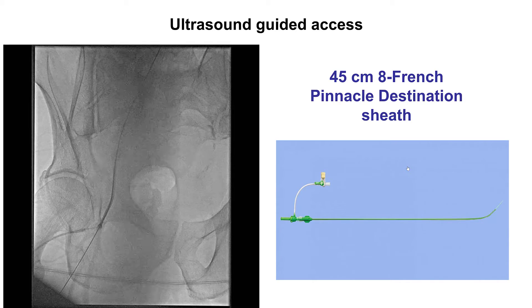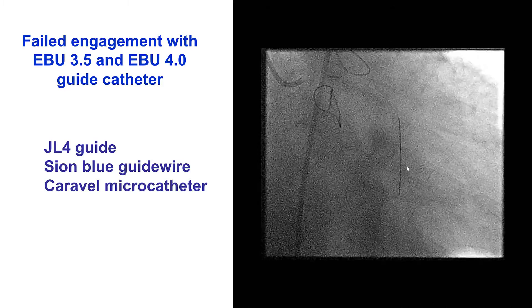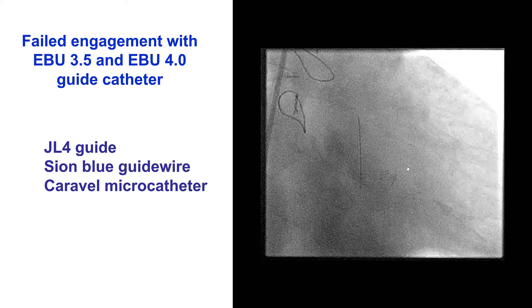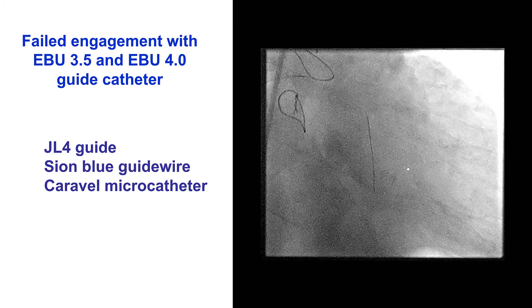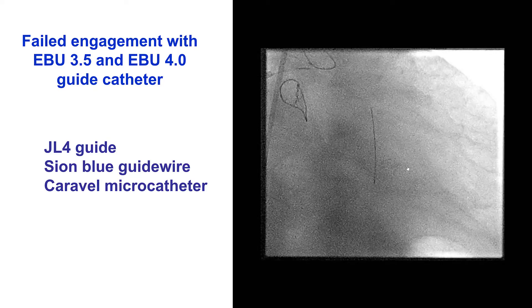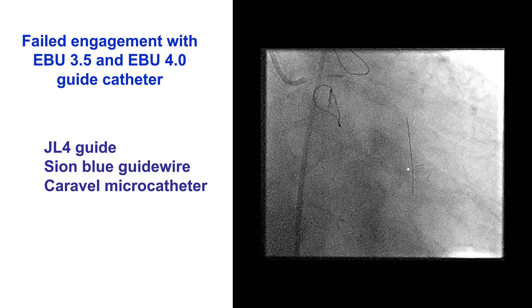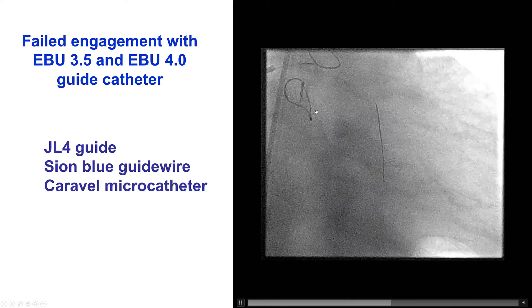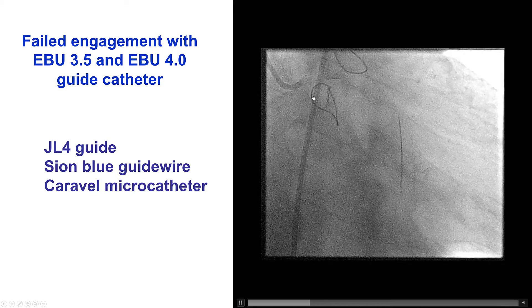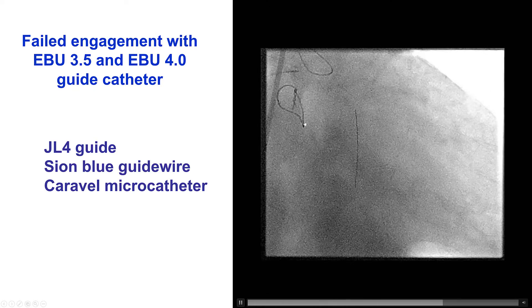Given the complexity of the lesion, we obtained femoral access with a 45 cm long 8 French Pinnacle Destination sheath. However, we had significant difficulty engaging the lesion. We were unable to engage despite using an EBU 3.5 and an EBU 4.0 guide catheter. As you can tell from the image quality, the patient was fairly large, requiring higher radiation dose and less angulated views.